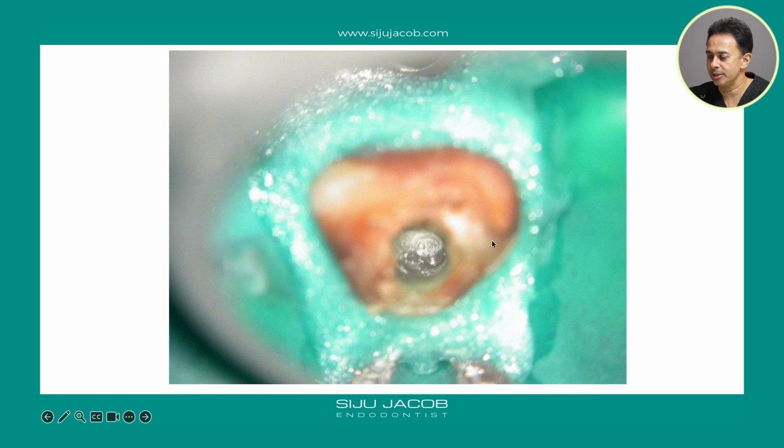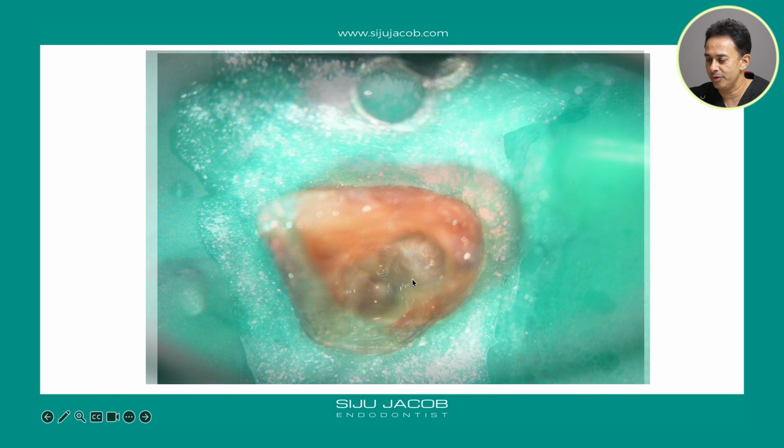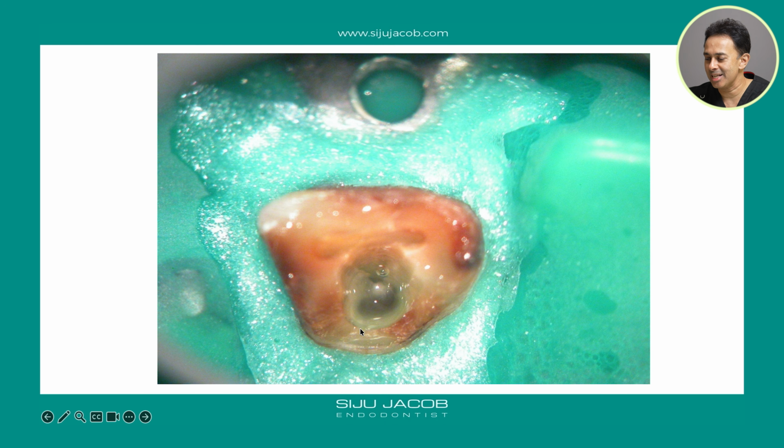We see a tooth like this, and traditionally we tend to see that the clinician's been looking labially and there is some sort of a whitish patch here, and this area looks dark. So this tells us that we probably need to drill down the palatal area here. But as we start drilling down the palatal area, something doesn't feel right. Instead of going deeper and locating a calcified portion, what we are seeing is a more glassy kind of surface.